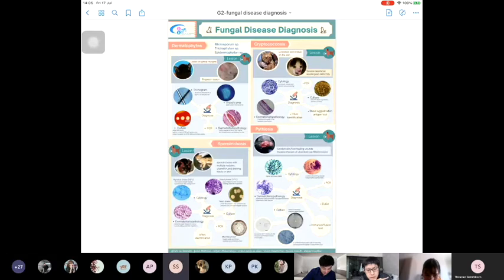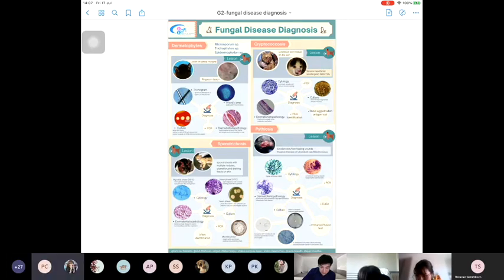And can we use other special staining for histopathological diagnosis of pythiosis? GMS detects the carbohydrate on the hyphae of Pythium. And are there any other special stains that stain carbohydrates that can detect Pythium? PAS can detect it but is less specific than GMS. Yes, PAS can also stain carbohydrates. Yeah, the answer is right. So that's all for my questions. Thank you.